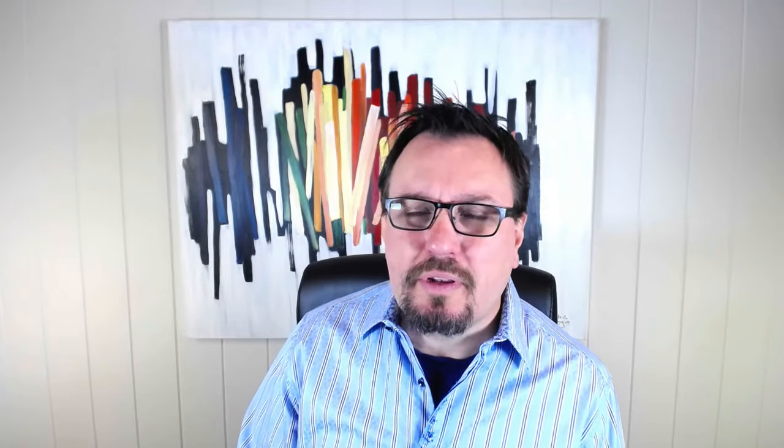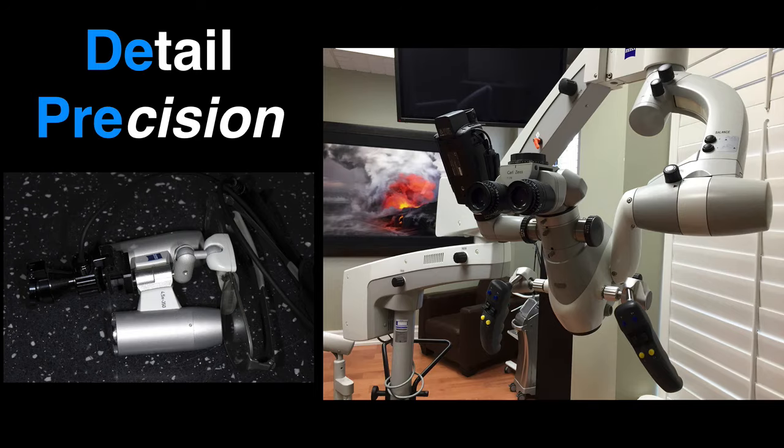I'm going to use some video filmed in my Zeiss microscope. Speaking to different ceramists over the last few years, one thing that they pointed out to me is that dentists sending cases into their labs for porcelain veneers are sometimes missing is rounding out the line angles or the transition points in the preparation.